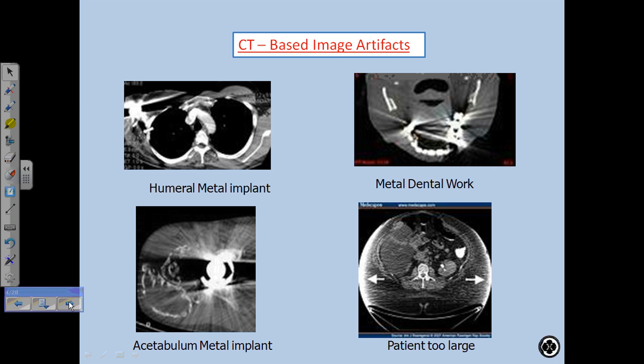That's not error. It's just black because when the X-ray tube came around, this humeral head completely blocked any information on the side, and so that information is lost. The newer scanners, and we're getting some newer scanners at Evanston, Glenbrook, and Highland Park hospitals, coming in the next few months, have metal artifact reduction algorithms, and so they can actually restore this somehow.